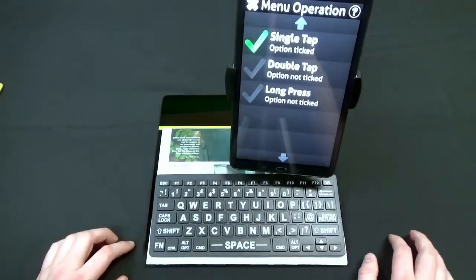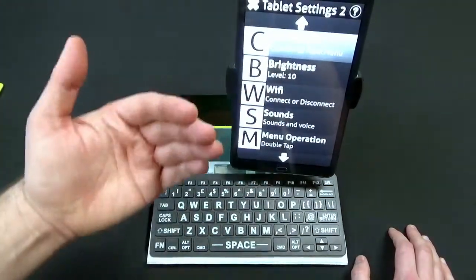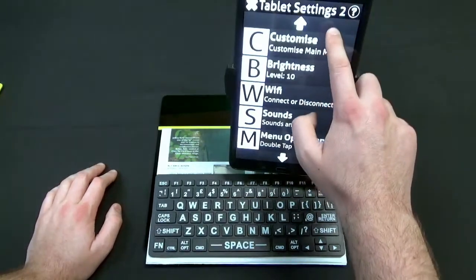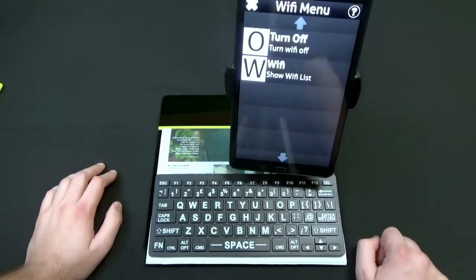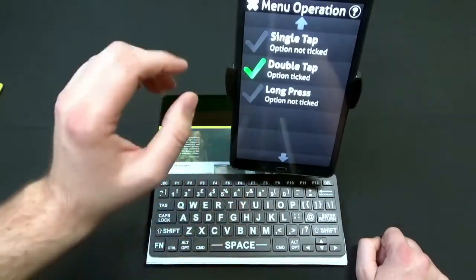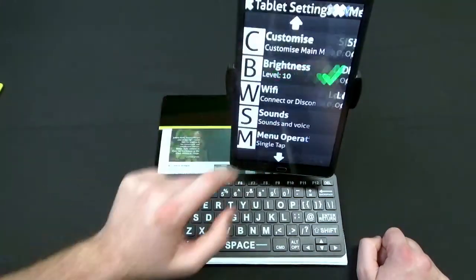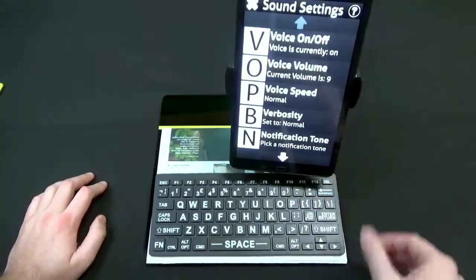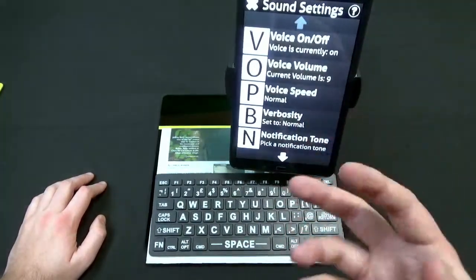In settings there are menu operation options. You can set it so that tapping something opens it right up, or you can set it to double-tap — single tap just reads it aloud, and double tap opens it. That way someone who's blind or severely visually impaired can drag their finger along and then double tap when they find what they want. You can also set a long press. In the sounds settings you can turn the voice on or off — if you just want a low vision interface without speech assistance you can shut that off — and you can adjust reading speed, volume, and verbosity.